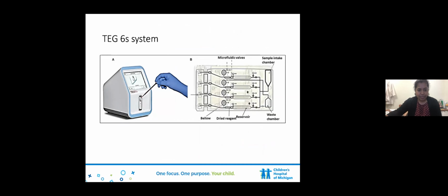And it's actually a multi-channel cartridge that allows 4 assays to be performed simultaneously. An LED detector measures the up and down motion of the blood meniscus, and the frequency leading to resonance change is identified, and that leads to the readout. So a stronger clot is supposed to have a higher resonant frequency and higher TEG readouts.